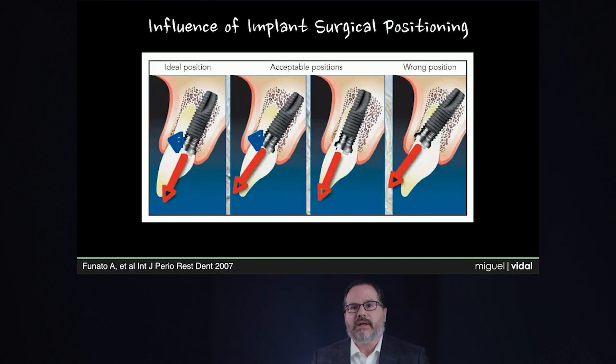When we talk about an immediate implant, the positioning is slightly different, as you see here in the sagittal view. The implant needs to go on the palatal wall and hug that bone and stay away from the facial plate of bone, and you can see how thin it is in these scenarios. So that's going to leave a space or a gap that we're going to graft with bone to support that area. You can see on the successive photos here slight deviations in the angulation of our immediate implant, how it potentially influences and affects the buccal plate of bone, and also changes dramatically the abutment and crown contours for our restoration.